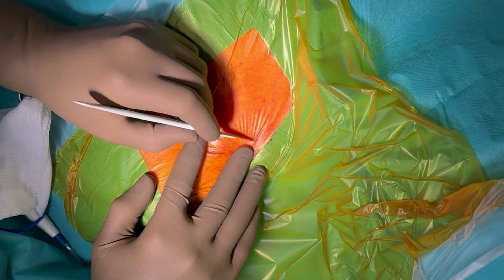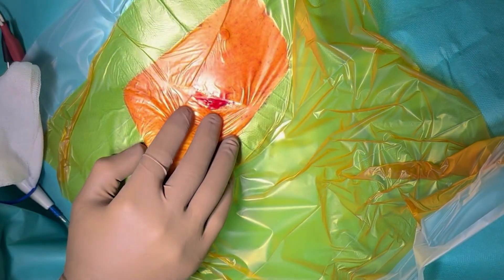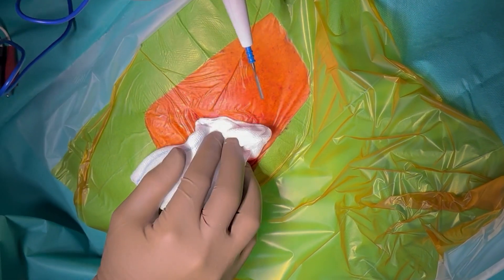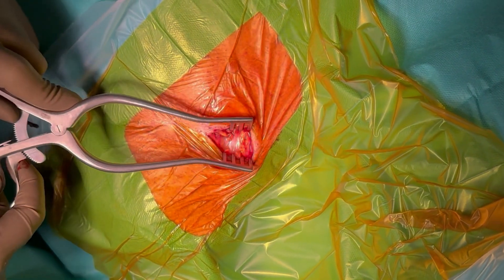In this video we will show you how to perform an axillary vein puncture. Today most cardiologists choose one of two approaches. The classic approach is the cephalic vein cut down. It has a very low complication rate but it requires significant surgical skills and is considered more time consuming.